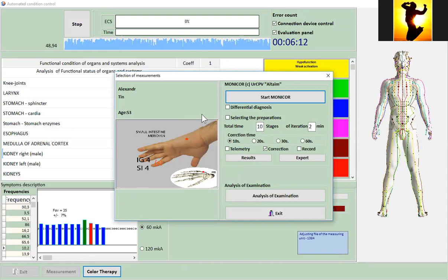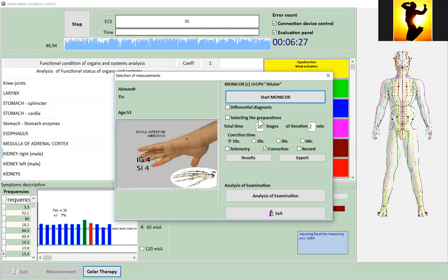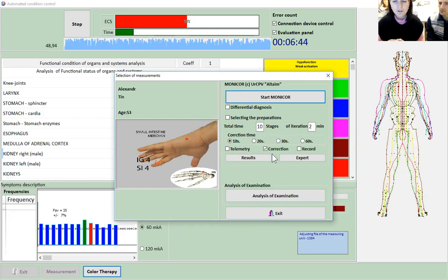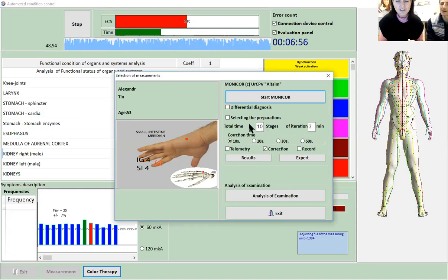Can I ask you a question about that particular screen? On that screen, you've selected 10 stages. Are stages minutes? It's not, it's total time 10, and then stages of iteration 2. And what is correction time underneath, 10S, 20S, 30S? You don't have to think about it. Before, there was much more you could do with this program. It was the research program, and some things are still on. So you always leave it on 10. You don't change anything, just the time and how often there will be a measurement.